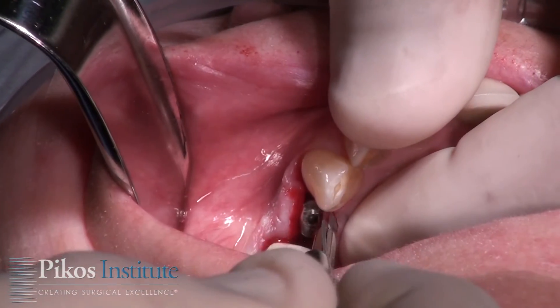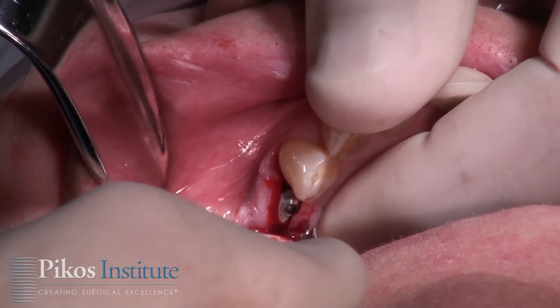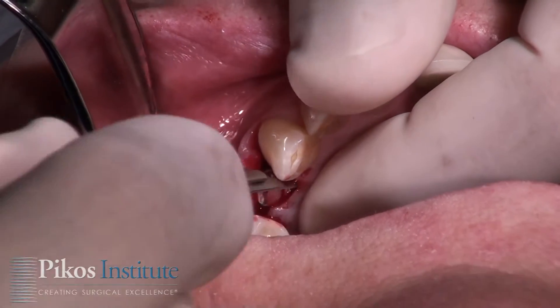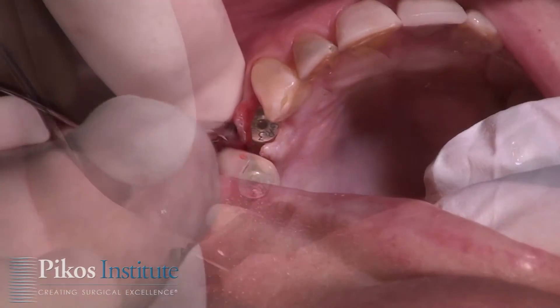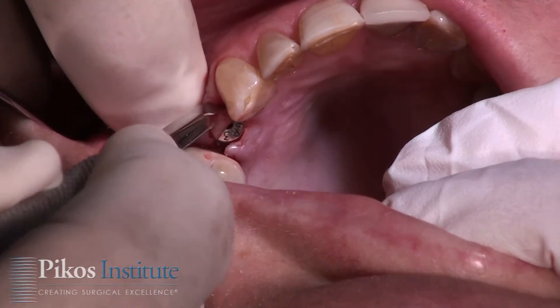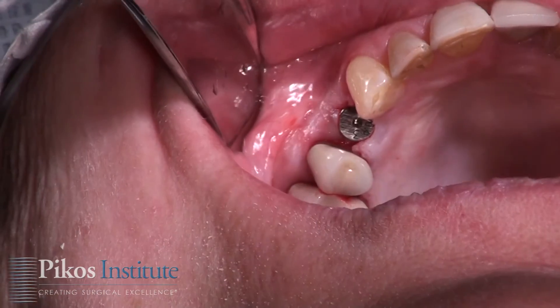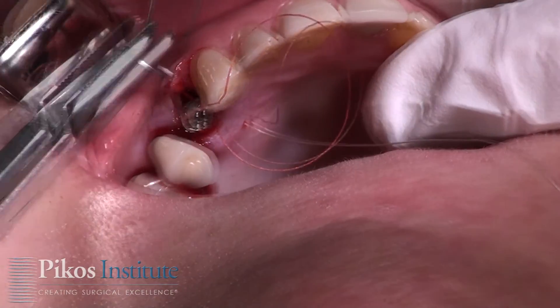Now we'll go ahead and close around the healing abutment. Our soft tissue closure will be such that we'll rotate some flaps to be able to get the closure we need around the abutment itself. In this case, since we have so much attached keratinized gingiva, all we need to do is an excisional flap design — a concentric resective piece — using a 15C blade. We're ready to close; we'll go with a 4-0 Vicryl and place two simple interrupted sutures.